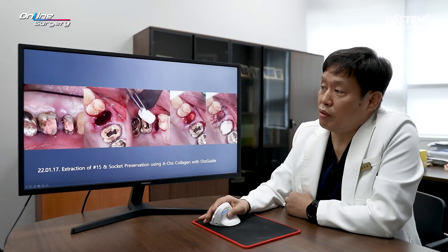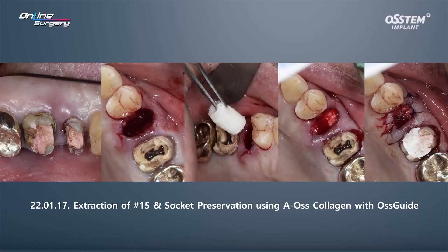The bridge was removed. Number 6 and number 5 — endodontic treatment was not done. Number 5 was extracted, and A-Oss Collagen and OssGuide was used. Suture was done and socket preservation was completed. On the palatal side, there was a bit of swelling, pus suction was done, and curettage was done.